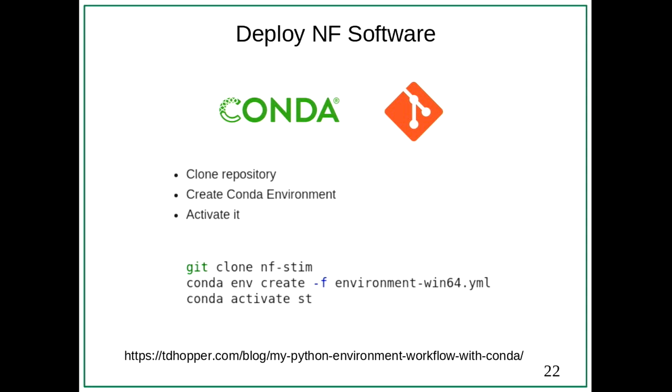It's in practice not as easy as that, because there are sometimes problems. For example, if you're on the eduroam network, then sometimes pip cannot verify the package that you want to download. But in any case, the main message is, in the end, this does work, and so I use this approach already to set up neurofeedback systems around Brisbane and also around Newcastle in Australia.